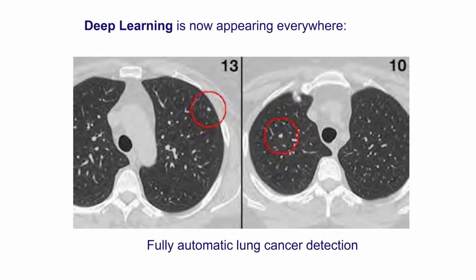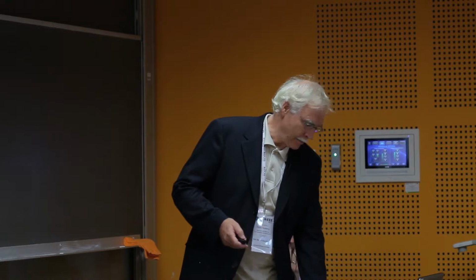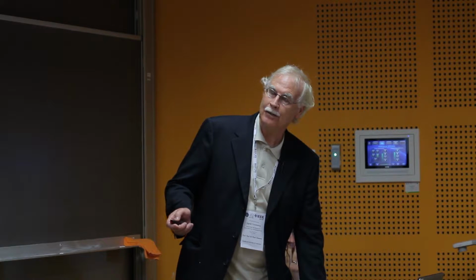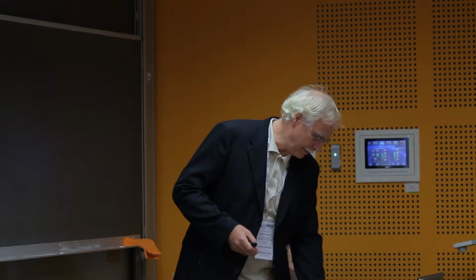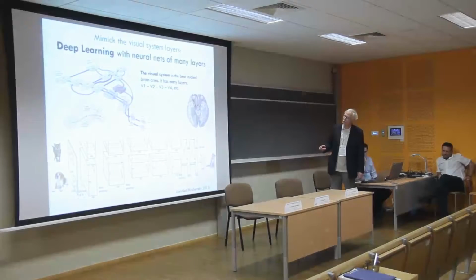But I go to deep learning, because that's now artificial intelligence taking over all these classical feature approaches. With deep learning, we now have fantastic results in finding, actually currently better than human performance, the detection of all kinds of malignancy in these images. And I'm going to talk a lot about deep learning. And why is it called deep? Because it has many layers in the neural nets.